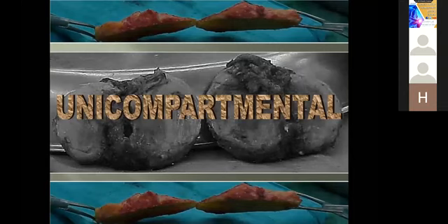Starting with the least constraint, as I said, the unicompartmental knee. What are the indications? The age of the patient is usually above 60 with low activity, which is changing nowadays. Articular destruction is limited to one compartment, reaching to bone, and the concept of anteromedial arthritis is now well pronounced. Stable knee, coronal and sagittal, intact anterior cruciate and medial collateral with minimal or no dissection and release on the medial side.